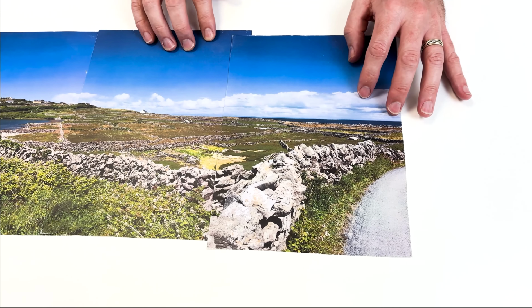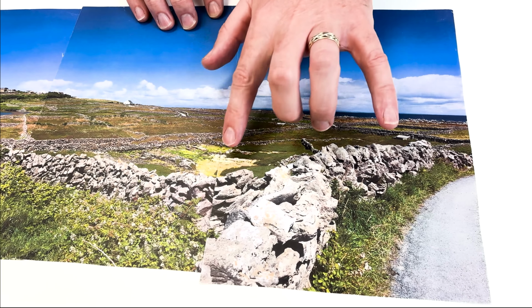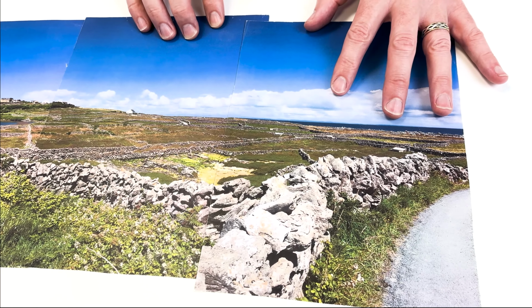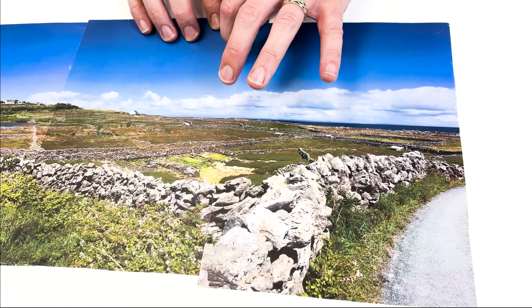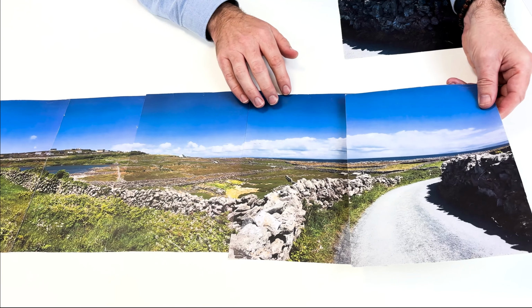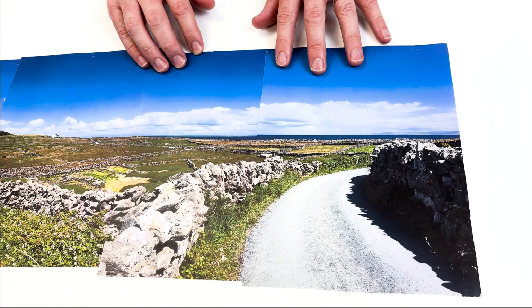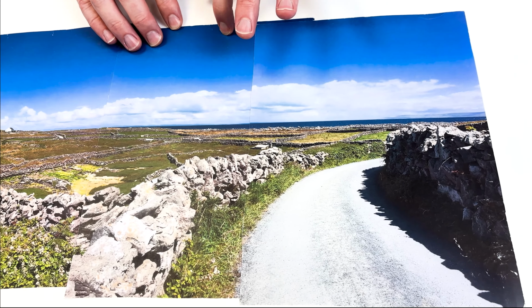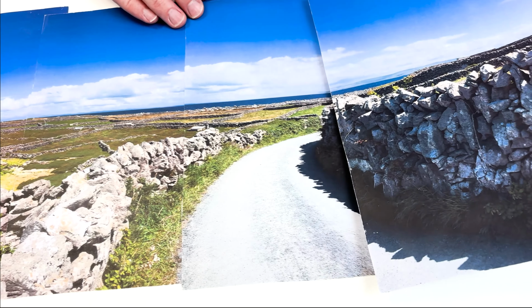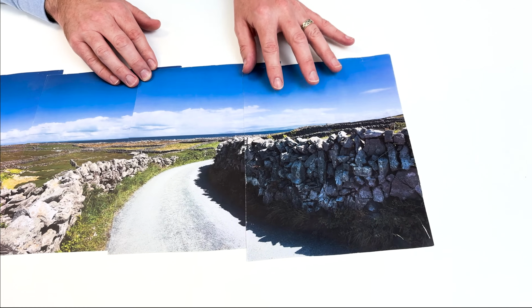So what we're looking at, of course, when we compare this to intraoral scanning, is a situation whereby the scanner is looking at teeth and the software is looking at all those intricate details and using them to align everything as best it can. And with an arch where we've got teeth, that makes life very, very easy for the software and for the scanner. The challenges arise when maybe we don't have teeth, we've got edentulous spans, and we don't have as much specific detail and information to work with.